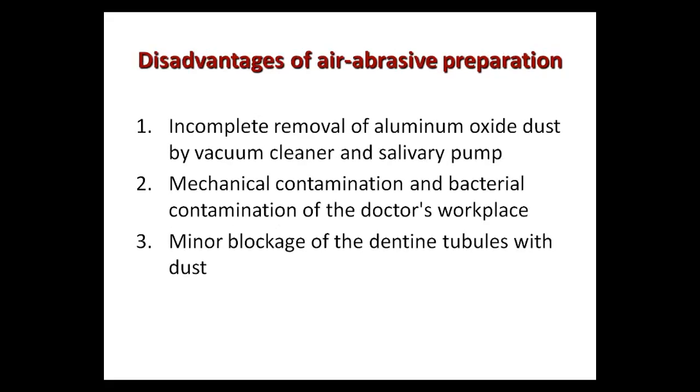As for disadvantages of air abrasive preparation: incomplete removal of aluminum oxide dust by vacuum cleaner and salivary pump, mechanical contamination and also bacterial contamination of the workplace of doctors, minor blockage of the dentinal tubules with dust.